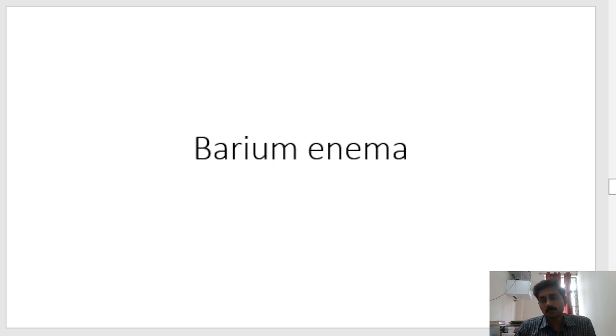What is barium enema? As I told you, these three pictures, swallow, meal, and follow through, are a single procedure taken at different intervals of time. Now we cannot ask the patient to wait for 12 to 14 hours in the X-ray room to make the contrast material reach the large intestine. It's not practically possible. So if we want to exclusively evaluate the large intestine, what should we do?